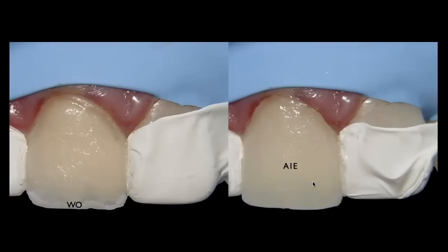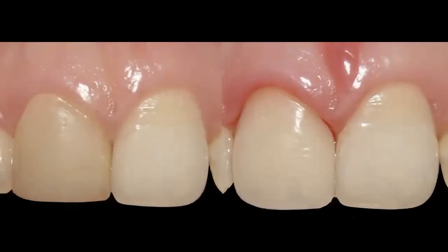And I'll show you how I go about the enamel layer in another case, but here is my enamel layer completely placed. I am ready now to remove my rubber dam, remove the Teflon tape, finish and polish, and this is immediately after removal of the cord and removal of the rubber dam. And you can see that, even though there's a little bit of dehydration on this tooth number 9 due to the rubber dam, the color match is almost on the spot. And we always want to tell the patient that our restoration is going to be a little bit darker once we're done, immediately after the completed restoration, because the neighboring teeth will dehydrate because of the rubber dam.